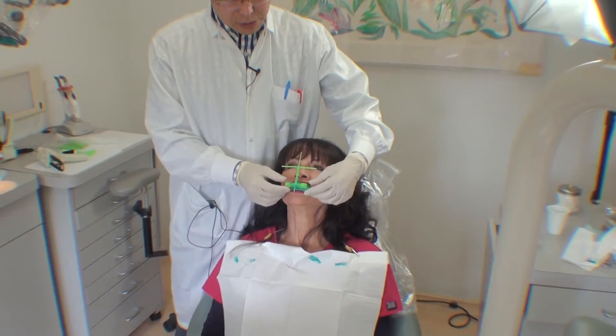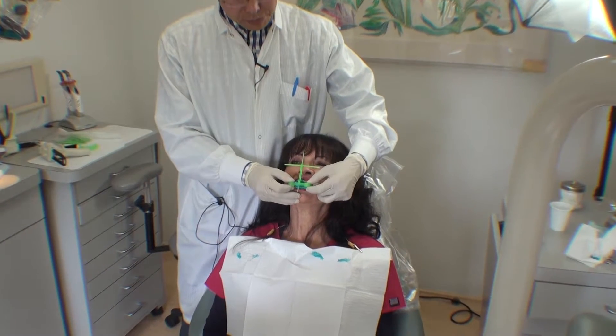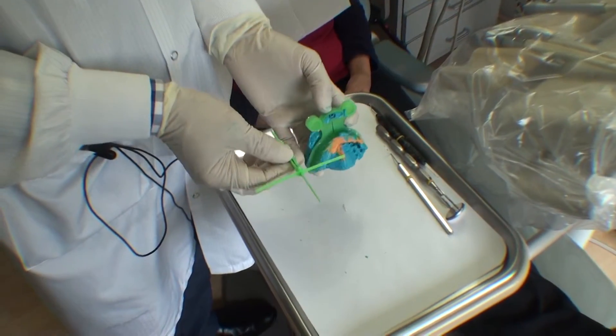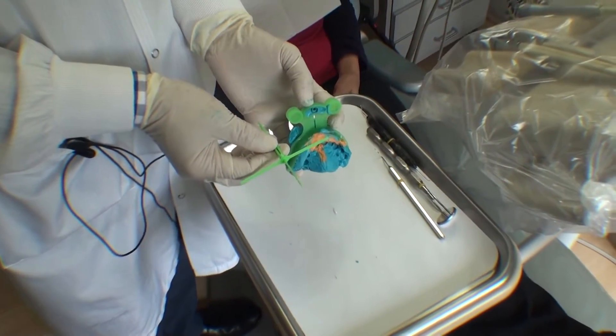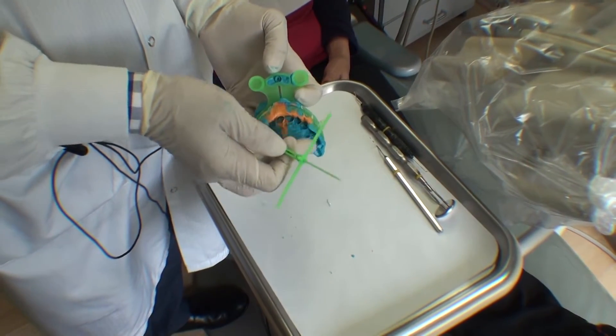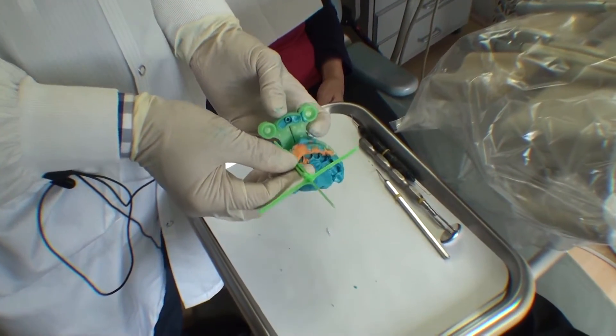Once the material sets, you want to take the entire tray out of the mouth. This is the whole assembly that gets sent to the laboratory technician. The first thing that the technician will do is to pour up the model and articulate it in an articulator.